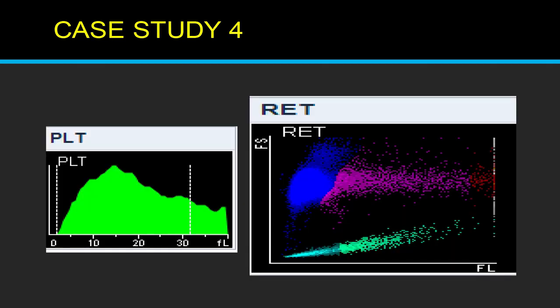You can again see that the typical platelet histogram is that of giant platelets, and the red scatter plot is again showing pretty high IPF. And that area to my right, which I am unfortunately not able to show, that is the zone of the high fluorescence IPF. I will now show 3 of our studies that we had conducted over the last 4-5 years to establish the role of IPF and certain other markers as a prognostic marker in dengue patients.